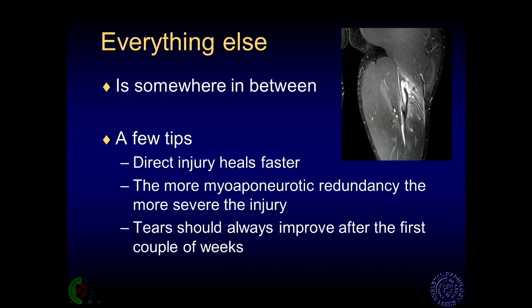So it's difficult to know when they become extramuscular to say there's tendon involvement for that classification system. And the other problem with the BAMIC is it's not really been around for a long time, so we don't, as yet, know what it means. So I tend to use the modified Peetrons, but I'm moving towards using a BAMIC nowadays.